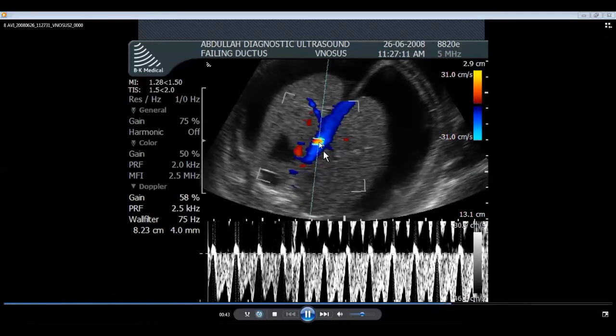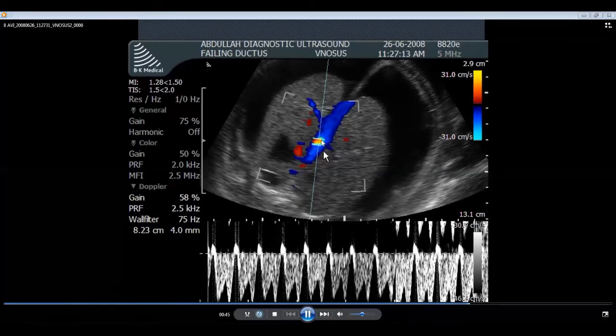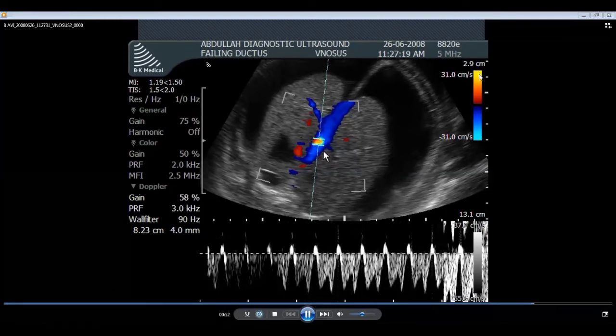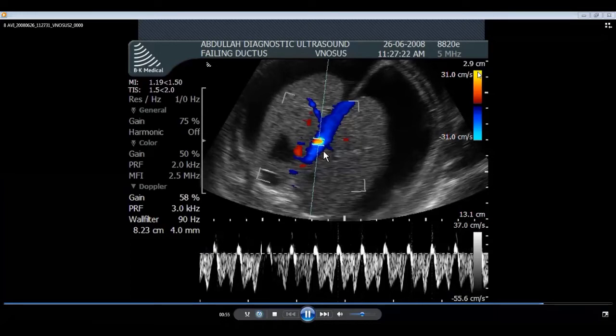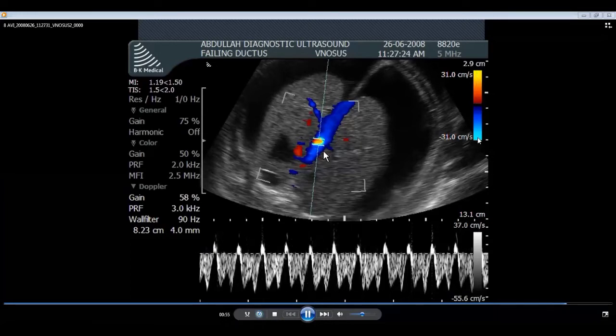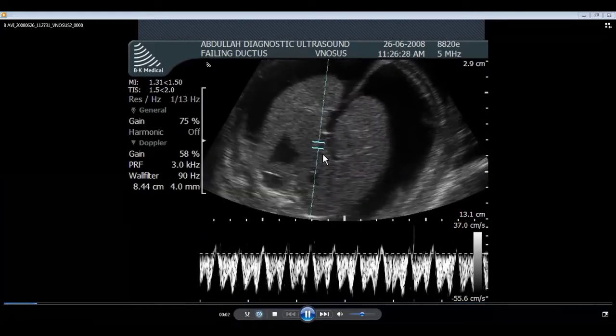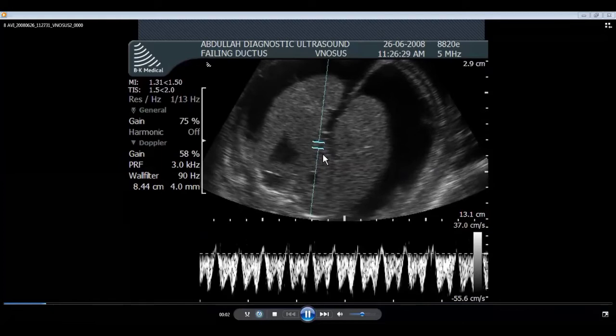This is ductus venosus, where we see mixing of colors, high velocity colors. These colors on this color palette are the ones which are bright and light, the yellow and the sea green color. They are high velocity colors as the blood passes through the ductus venosus.